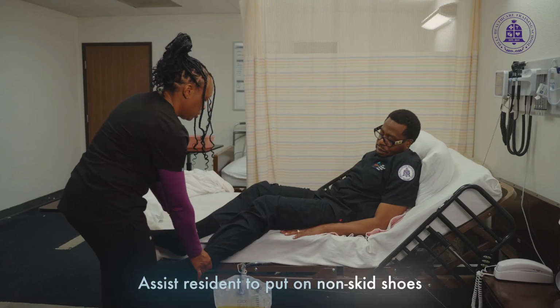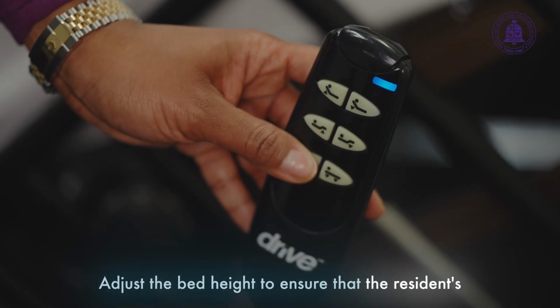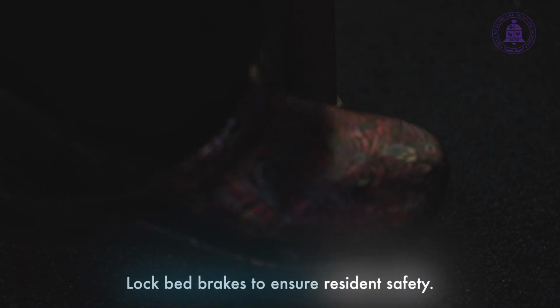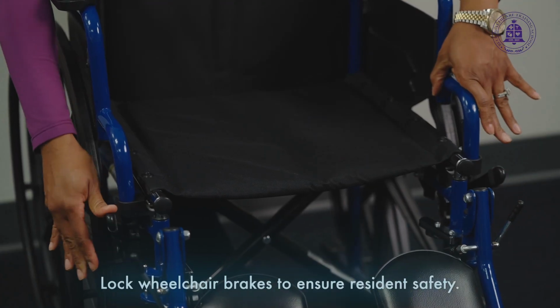Assist resident to put on non-skid shoes or footwear. Adjust the bed height to ensure that the resident's feet are flat on the floor when the resident is sitting on the edge of the bed. Lock bed brakes to ensure resident safety. Lock wheelchair brakes to ensure resident safety.